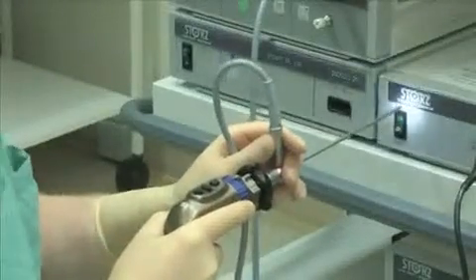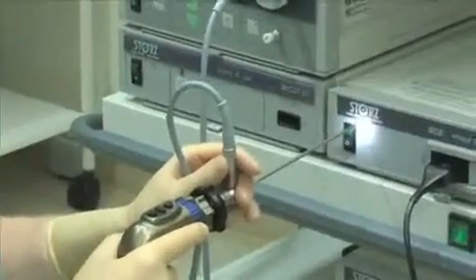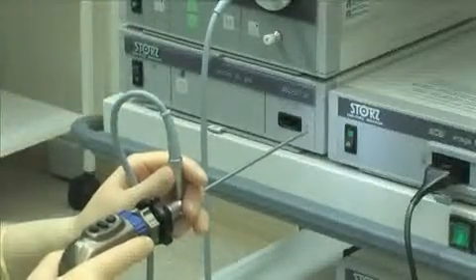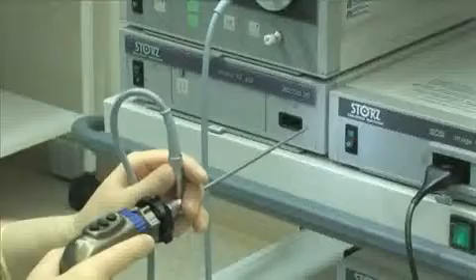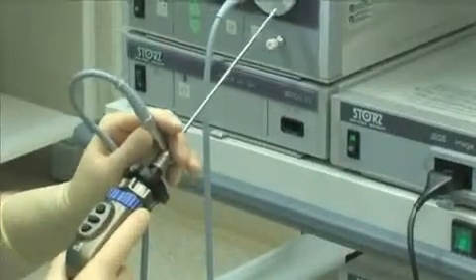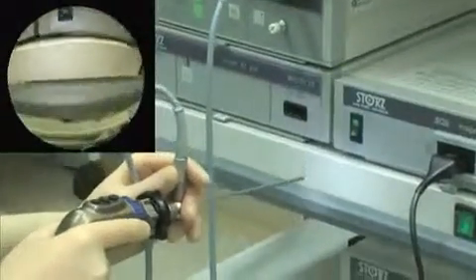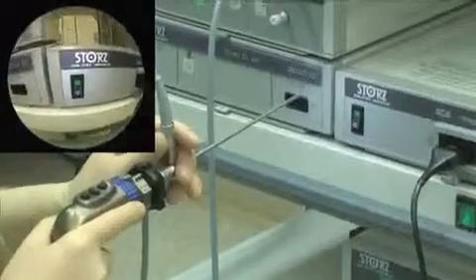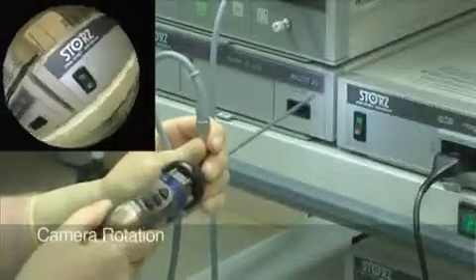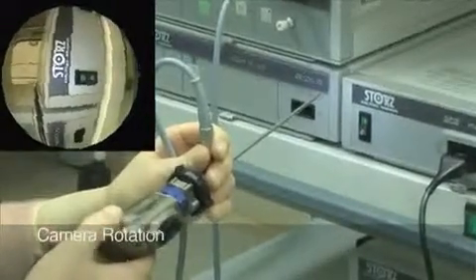By advancing the endoscope, we can clearly identify the structure. Retracting the endoscope gives us a better field of view, which is essential for orientation. In the course of moving the endoscope up and down, the entire arthroscopic tower can be observed. By rotating the camera, the picture on the monitor can be turned, while the endoscope remains in a constant position.